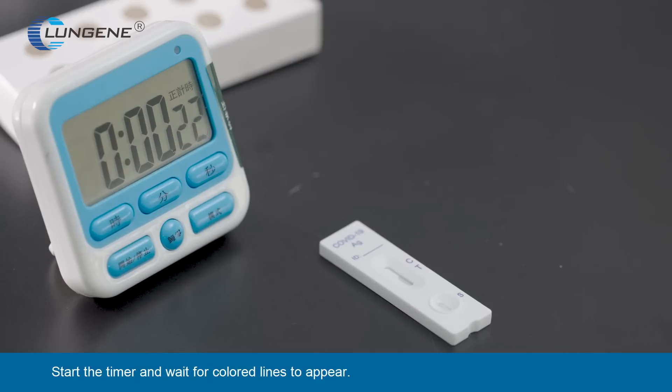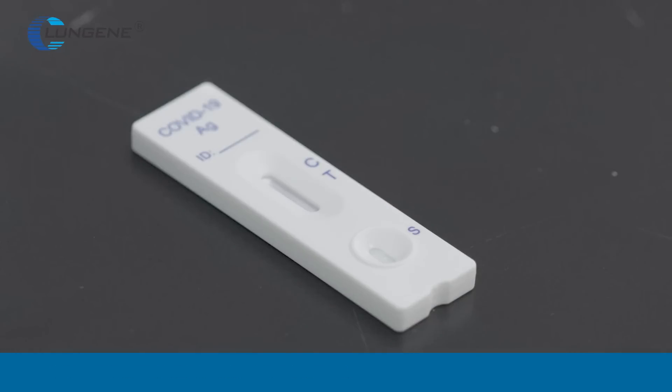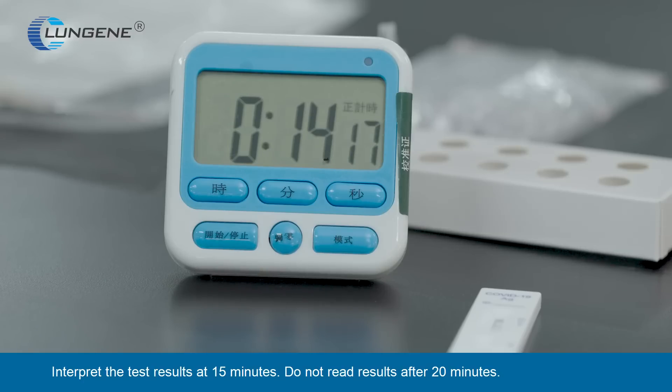Start the timer and wait for color lines to appear. Interpret the test results at 15 minutes. Do not read results after 20 minutes.